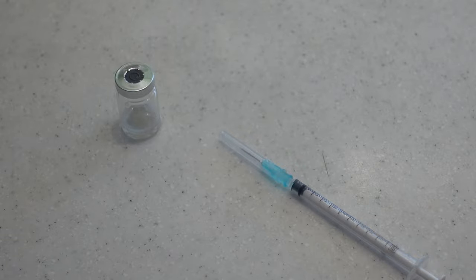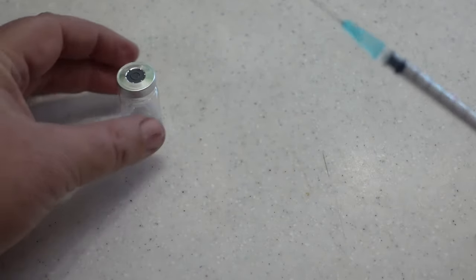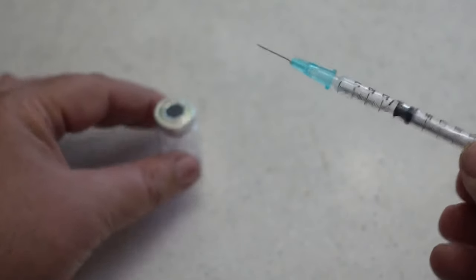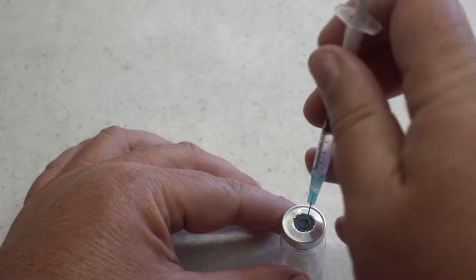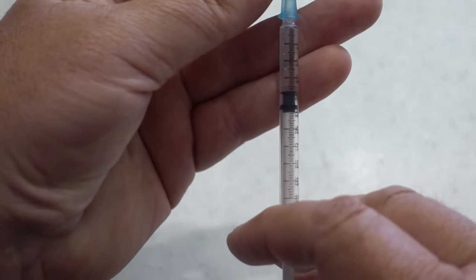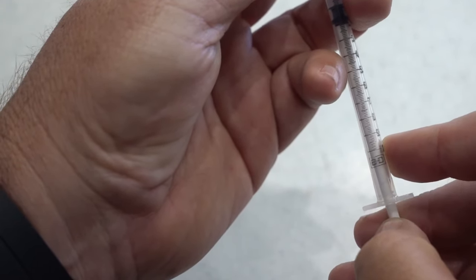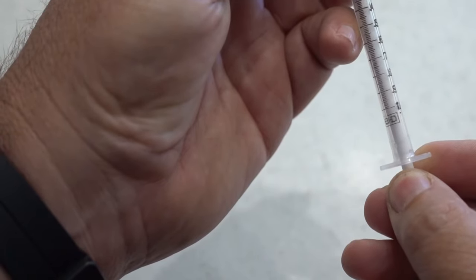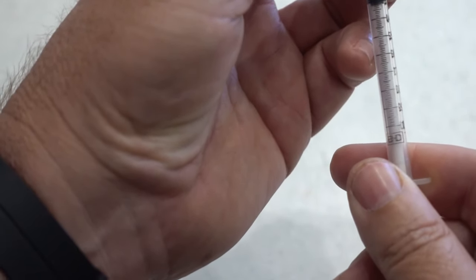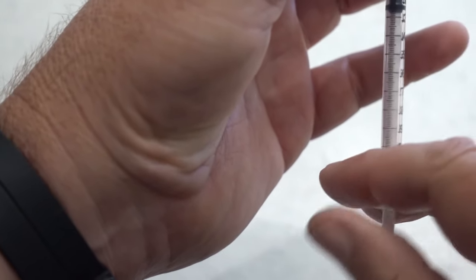To draw up the semaglutide from the 5 milliliter vial, first remove the cap from the TB syringe. Draw a little bit of air so we can put a little bit of pressure on the inside, then poke this through the self-healing injection port, turn the whole thing upside down, press on the plunger, and draw up 0.15 milliliter of semaglutide — go just a tad past and bring it back to 0.15, and there it is.